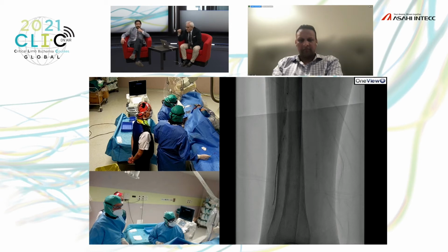But when I tried with this to rotate, the efficacy was very poor. If you try to have a very slow motion in the tip, so you try to use the one-to-one torque control on the tip, the effect is to exactly rotate the tip towards the new direction you want.